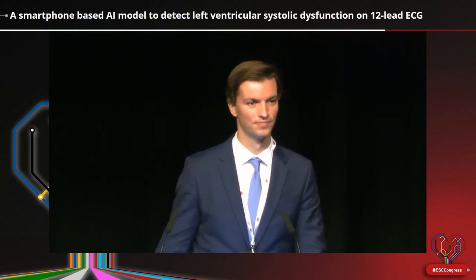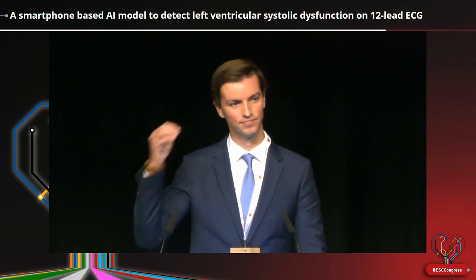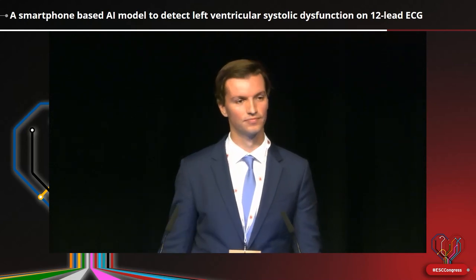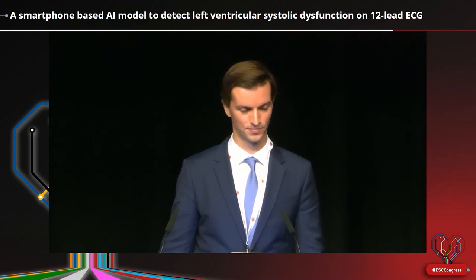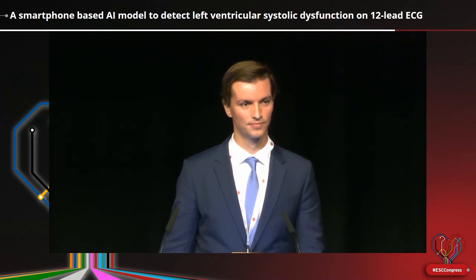Can you explain how the accuracy of the model developed applies when you take a picture? And the other thing, maybe it's more like a comment. You mentioned the very high area under the curve, but it's true, as you acknowledge at the end, that it was only internal validation because it was a random sample. So it's likely that there might be overfitting, and I think it's important to validate in different settings and different populations.